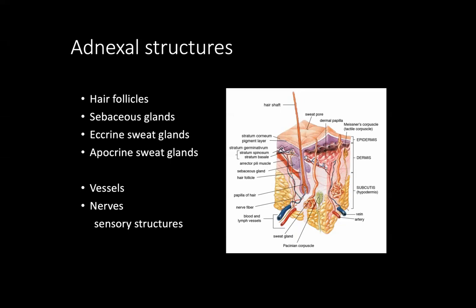So all normal components of the skin can lead to dermatopathology, and that's why you really have to understand the normal structures. One thing I failed to mention is the erector pili muscle.